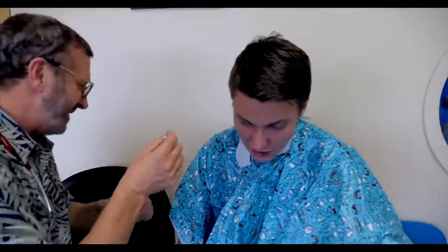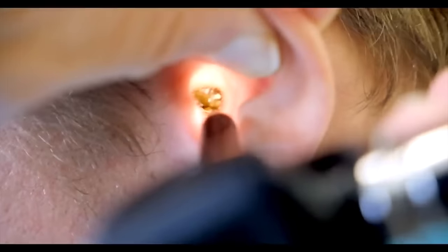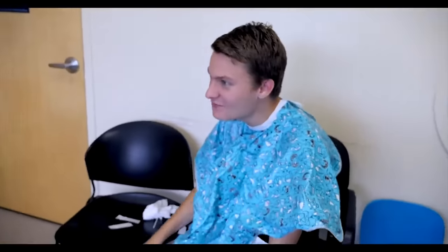All right, I'm just going to dry your ear just a little bit. Your ears are sensitive. That's it for that side. So we're just seeing a chunk of wax through the ear canal — we're going to work on that with some water. It can't just have a slang name like Max; it's got to be like Maxwell. It's got to be a full name. Maxwell. A strong name — a name with some clout.